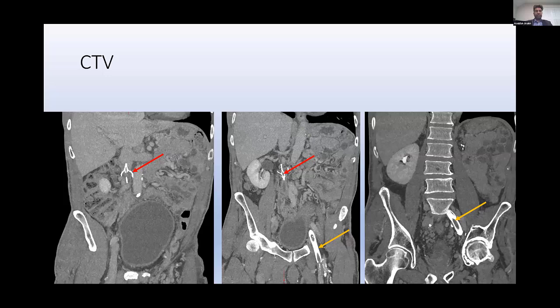The first image on the left has an arrow pointing to the permanent IVC filter — likely a trapeze — and you can see all the hypodensity within it, suggesting chronic material. Orange arrows point to the stent extending all the way down, and you can see material within the stent. It does extend up to the IVC confluence. The contralateral side was not occluded.